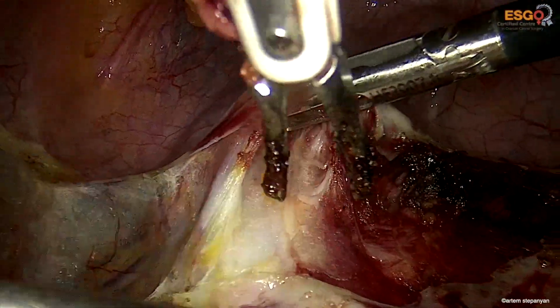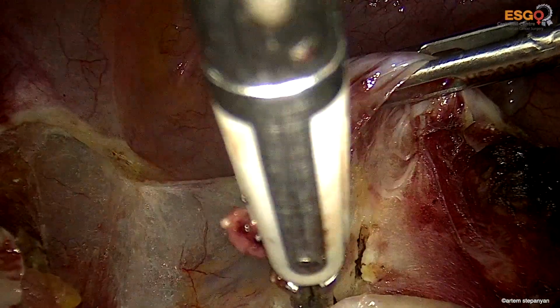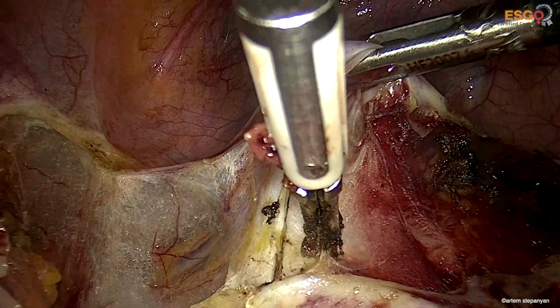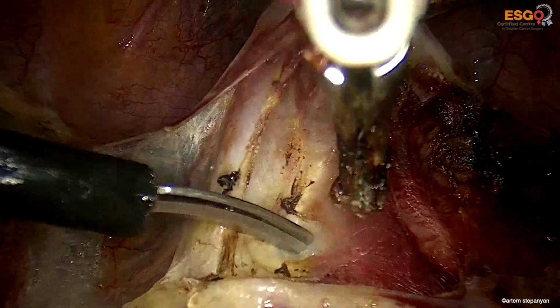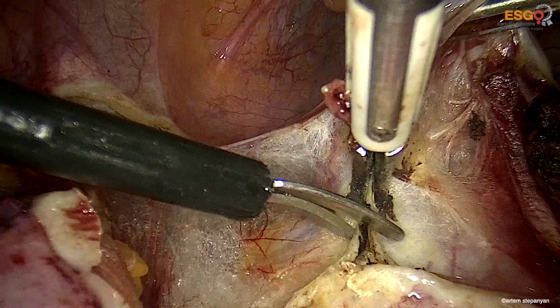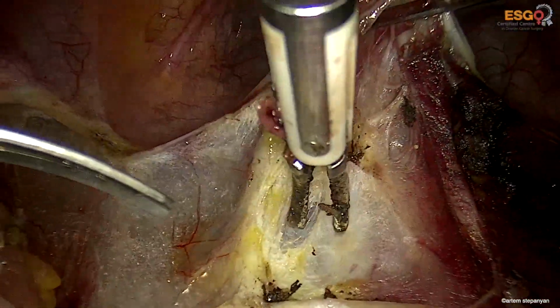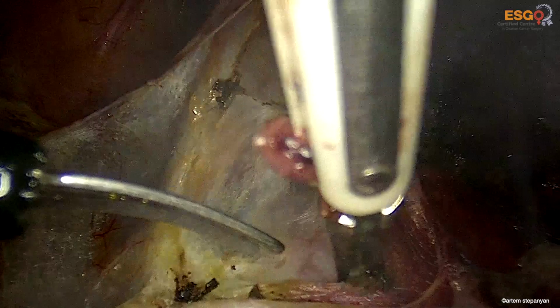The next step is very standard. We just detach the bladder from the anterior cervix and the anterior vaginal fornix. This is a very typical step for all laparoscopic hysterectomies.